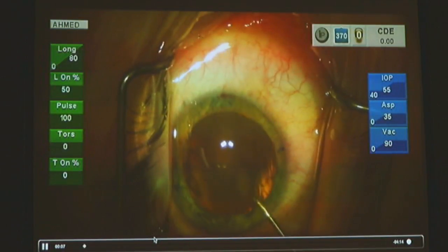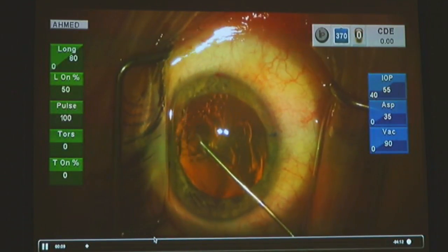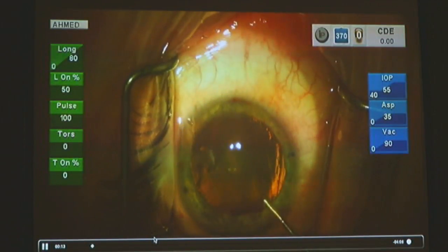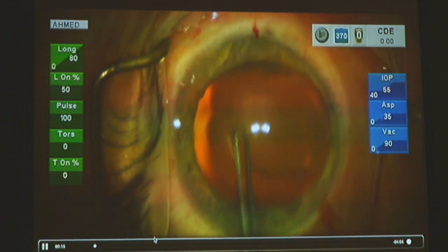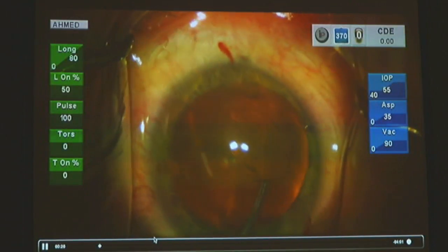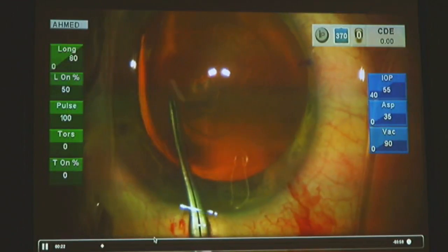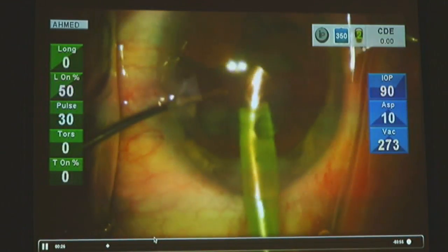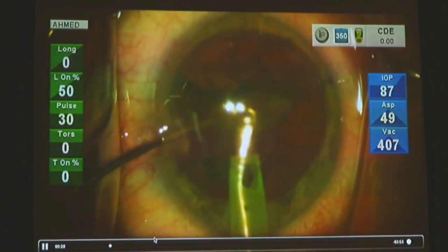And she really, really pushed me to say, can I put a multifocal lens in my eye? I said, no. I don't do a lot of multifocal lens in one eye only in young patients. I don't know. I don't find them to be as happy. And then I know I have to suture her pupil down. So I'm not sure if she's going to be unhappy. Then what do I do then for her lens, you know? And of course, with the pupil being small and not reactive, then how will this impact it? So these are all considered.